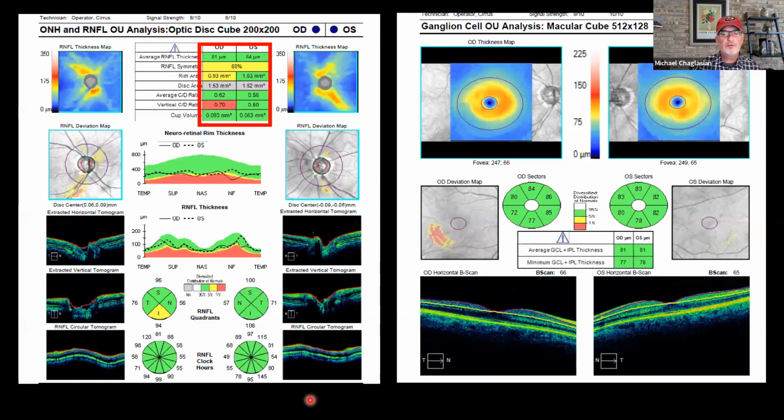The next thing to do is to work towards getting all the information in front of you on a display, on a monitor that you possibly can. Hopefully many of us, all of us are probably working in some sort of electronic health record environment. Sometimes electronic health records do a decent job of showing us our OCT reports and images and visual fields. Sometimes they don't.